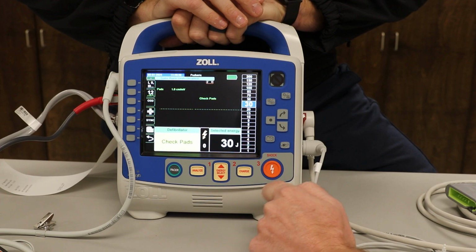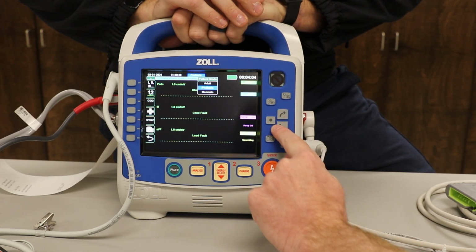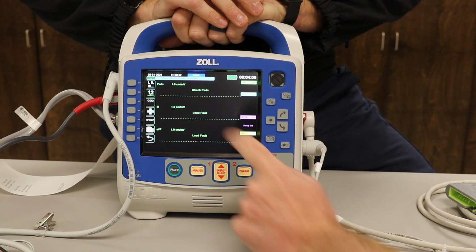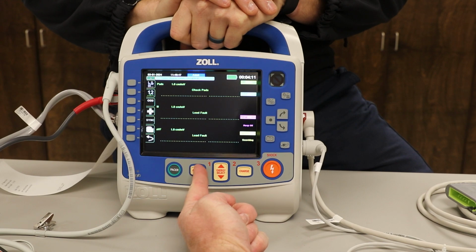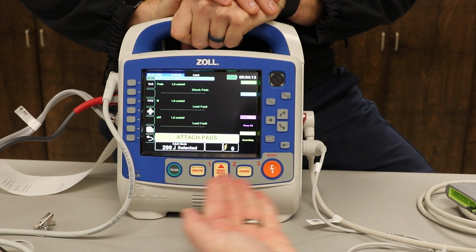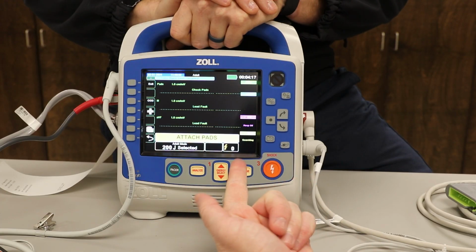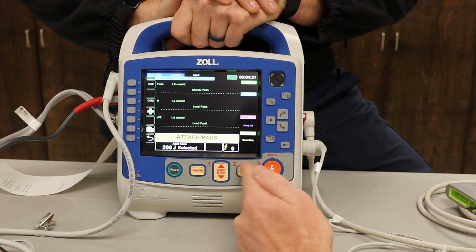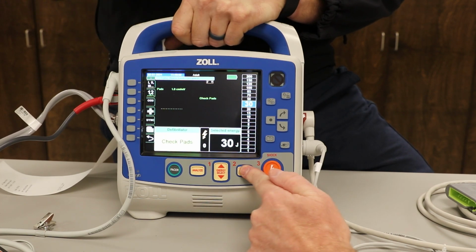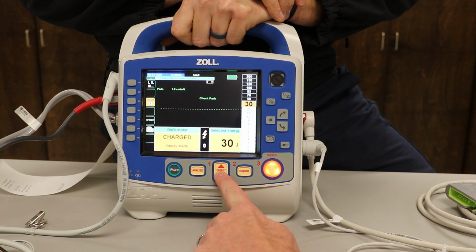Oh, I'm staying in pediatric mode. What do we do now? There we go, it's highlighted over. I push the button. Now I make it into adult or pediatric. To turn into AED, we're going to push 1 to analyze. Attach pads. It's going to tell you once your pads are on whether you shock or no shock. If it says shock, you push the charge and shock. If I need to dump the joules at any moment in time, I can either push the disarm button or I can go up and down.